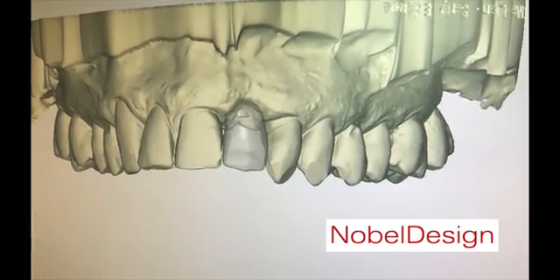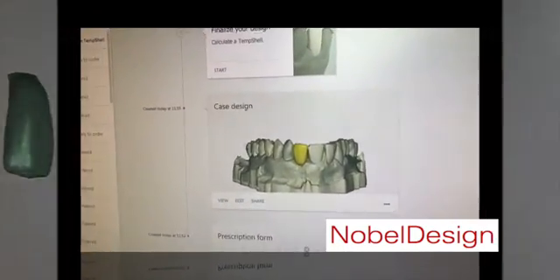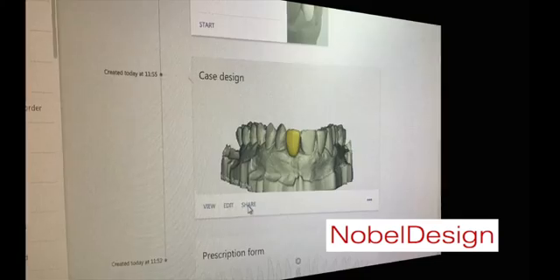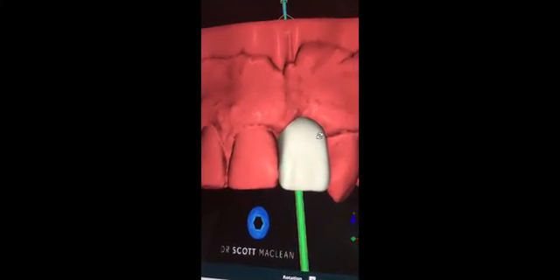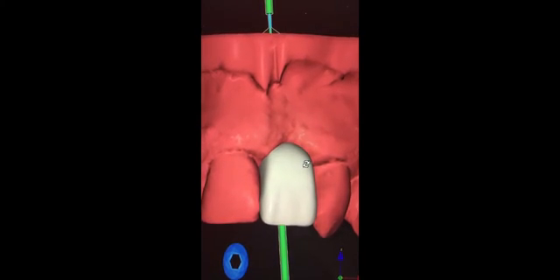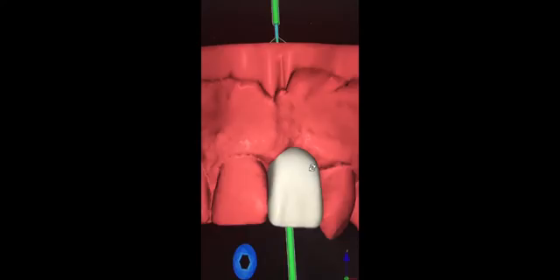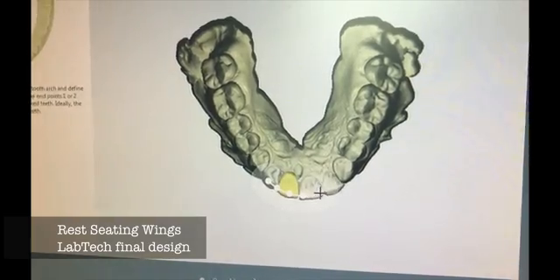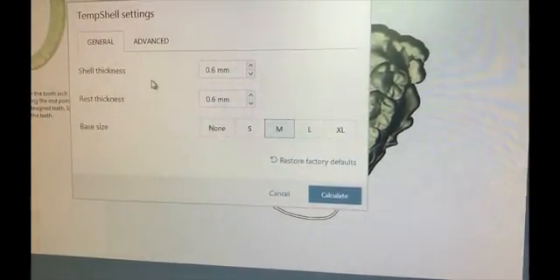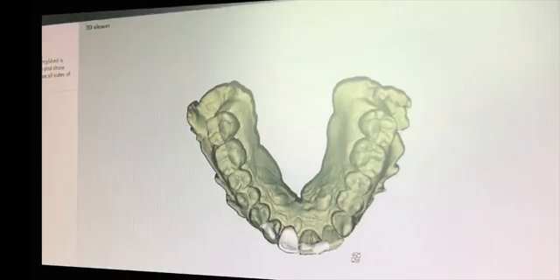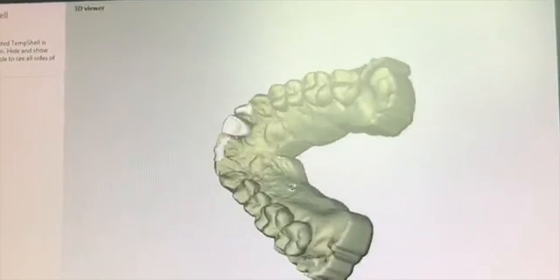Once they're done, they'll use Nobel Design and do what's called a share, sending the file back to the doctor for review. I can look at this in my own Nobel Clinician software — I can see it's a bit bulky, so I want them to cut it back, though I could do this chairside as well. Then I'll say yes, it's a go. The lab will then add rests next to the adjacent teeth, selecting thickness to support the temp shell in position for pickup over the implant.